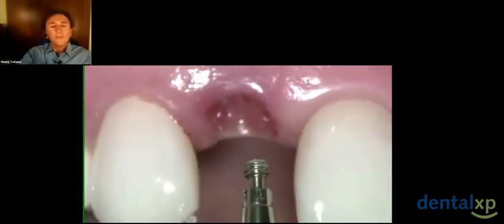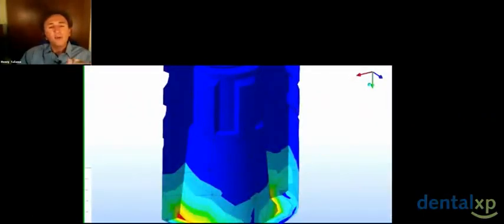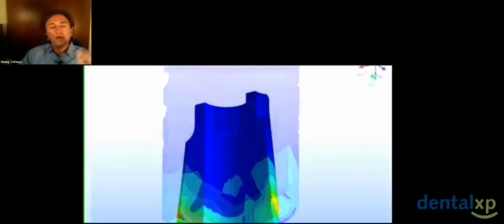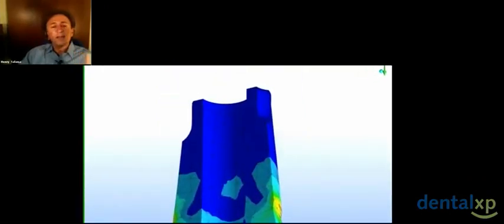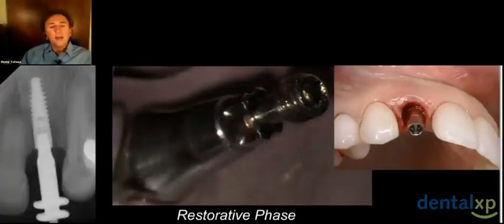We have an indexed abutment previously, and we have a Morse taper connection, which is bacterial seal, is excellent, and at the same time the stability creates a very rigid stability. Previous to this, previous to the CX, we didn't have an index, so only relied on a stent or a guide to put us in. Today with the CX, we don't need that, but we still have the other advantages of the Morse taper for an excellent stability.